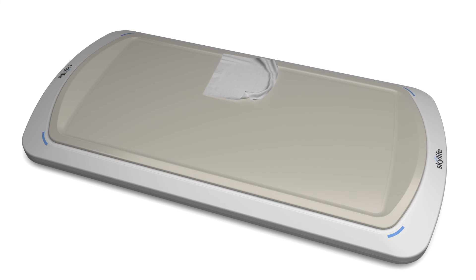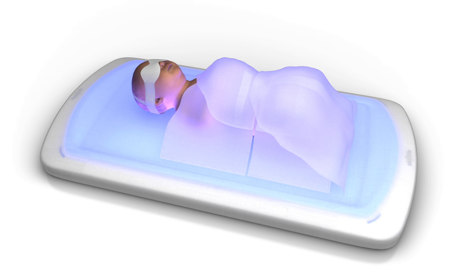The SkyLife device is to be cleaned using standard cleaning cloths prior to use. You may clean the non-body contact areas, such as the gel mat, controller, and power supply of the SkyLife system, using standard cleaning wipes. Do not remove the gel mat during cleaning.